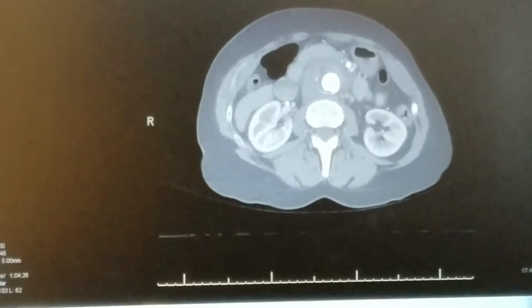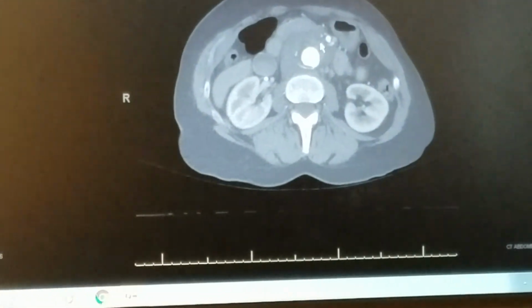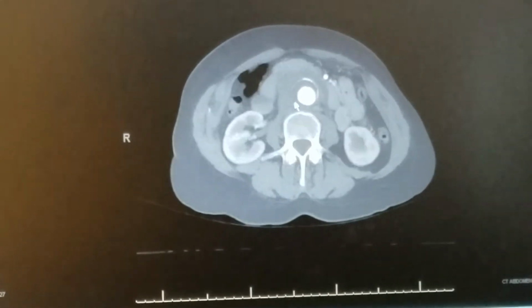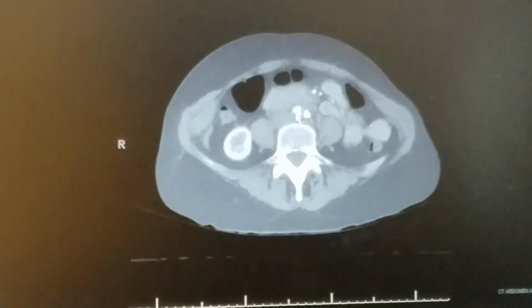She has that bulge again. But if you look around here, all this is thick. Yeah, what is that? That's para-aortic tissue swelling or inflammation. And it's the whole vessel. See how that looks? Gosh, yeah. And how different it looks compared to the last image.